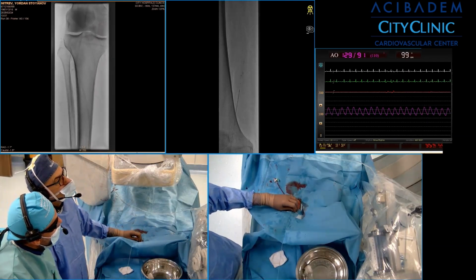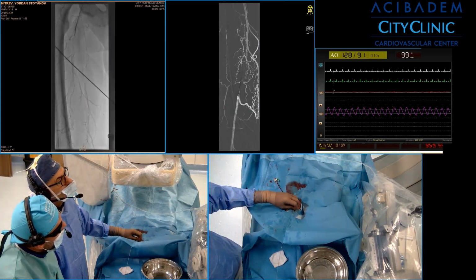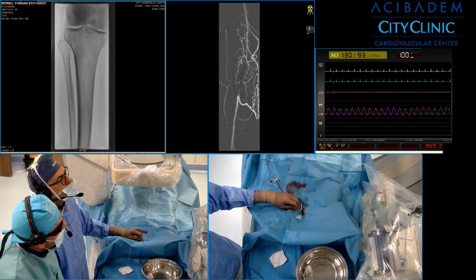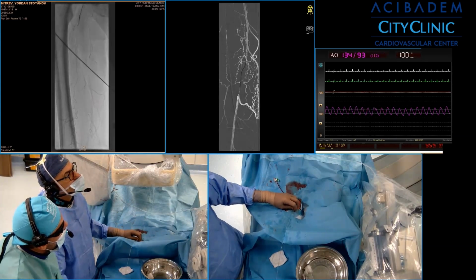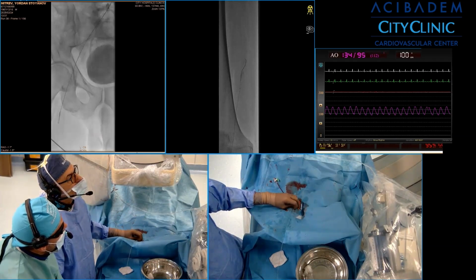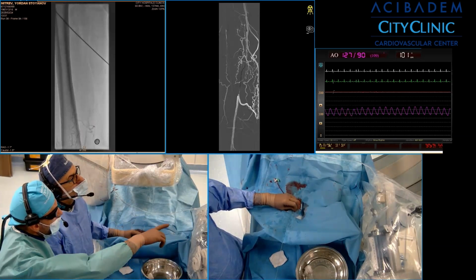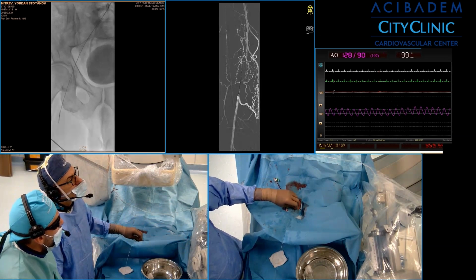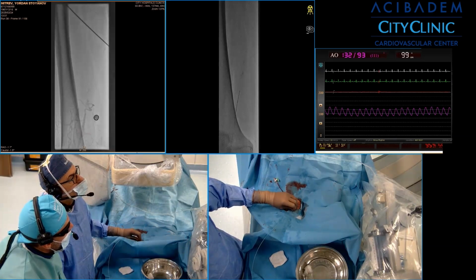And for now we try going from the medial part of the artery. We retracted slightly back. Go ahead. No, it's definitely subintimal. Oh, this is Command. Let's try crossing from the other side of the calcium. Remove the roadmap. Okay, we are retracting back and trying again.